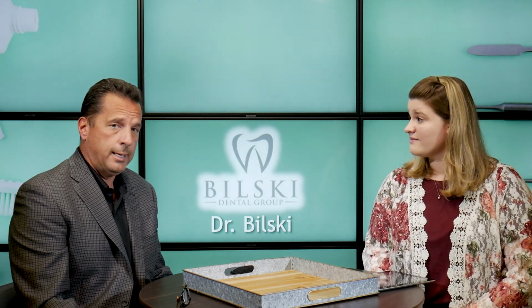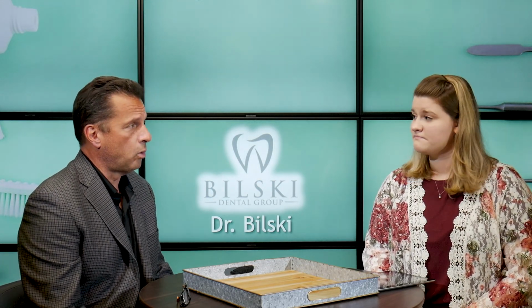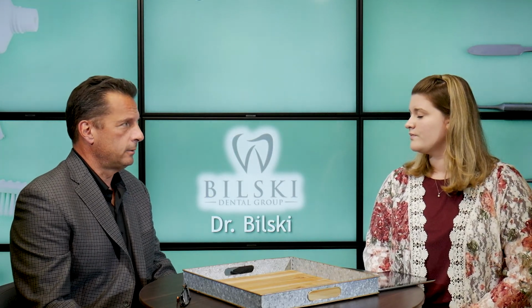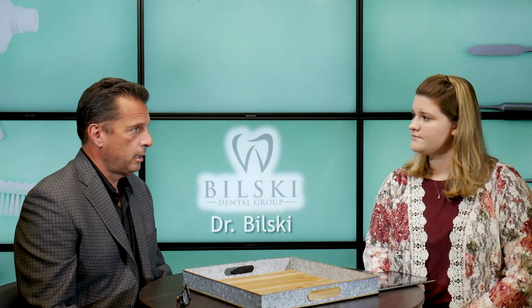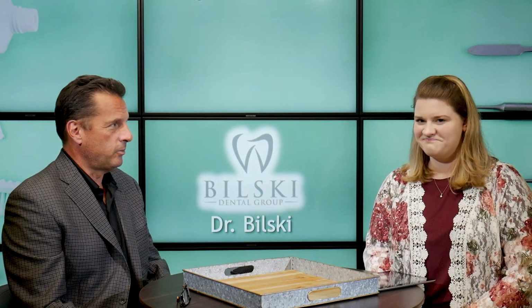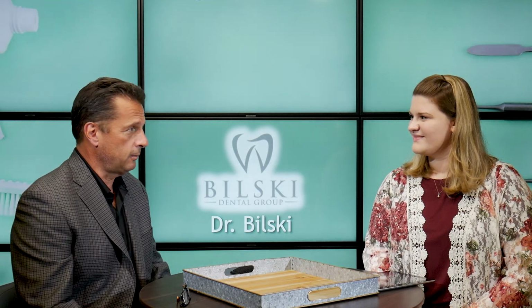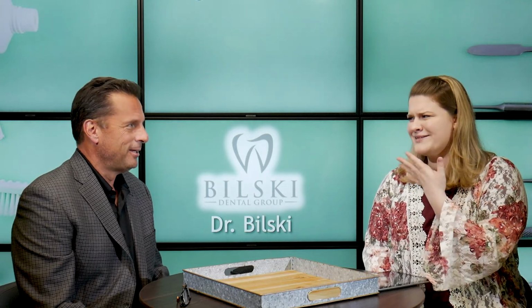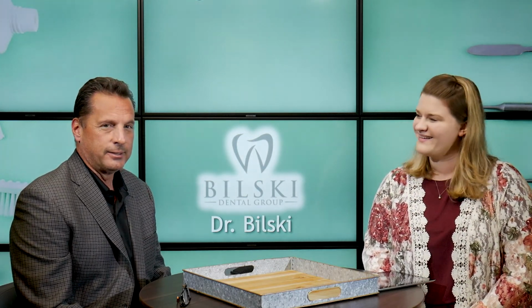Correct, and that is an example of a molar, a first molar. That's the most commonly drilled, filled, root canal crown tooth in your mouth. Of course, we can do it with front teeth too. Right. We can make smile design teeth. Yeah. We can make them look pretty. We can change the color. And it needs to match. If it's in the front, you don't have to be bright white, and then the rest maybe aren't as bright. Exactly.